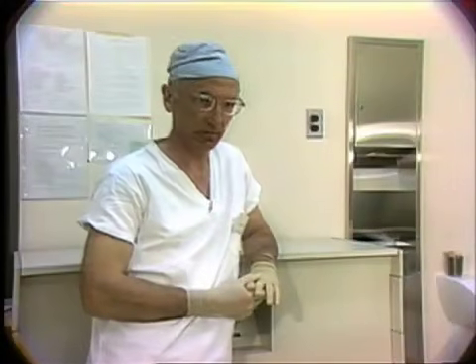With the help of a simulated patient, we would like to demonstrate treatment planning and instrumentation in oral surgery. The establishment of a treatment plan depends upon a diagnosis that must be firmly established before we begin anything in the way of surgical therapy, because surgery is final. There's no remaking or redoing what we carry out for this patient.